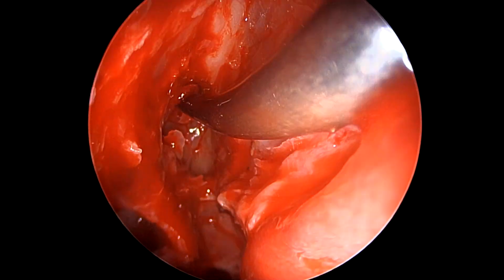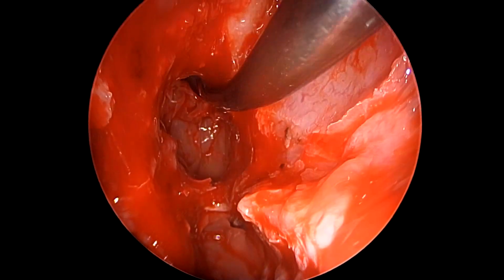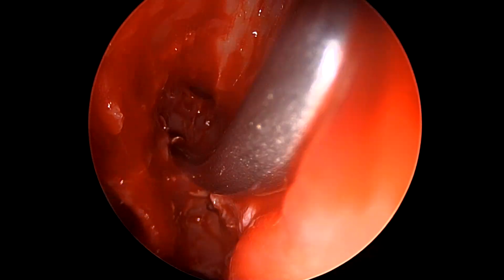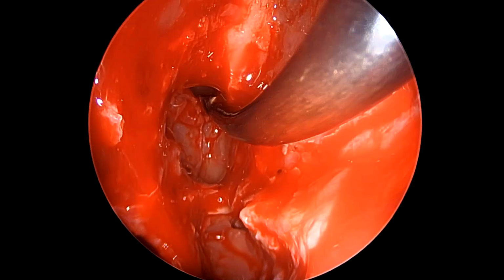As you see, these are T3 cells. So it basically means that it is pneumatized above and from anteriorly. You have to break these cells from posterior to anterior. But because of this strange angulation, we are not able to go behind this cell since it is so high. If this was a low-lying cell, we could have gone behind the cell and fractured it anteriorly.